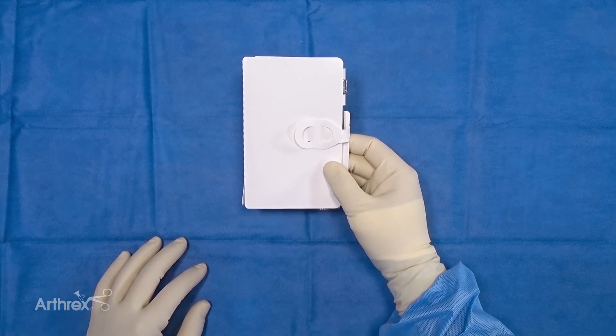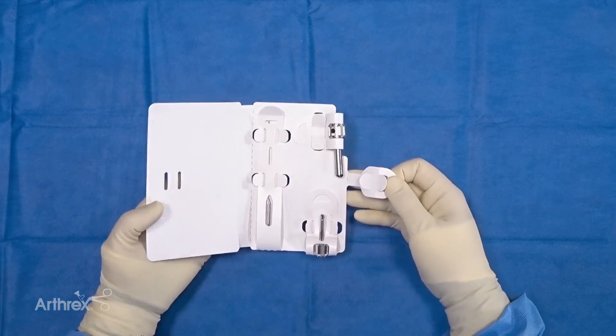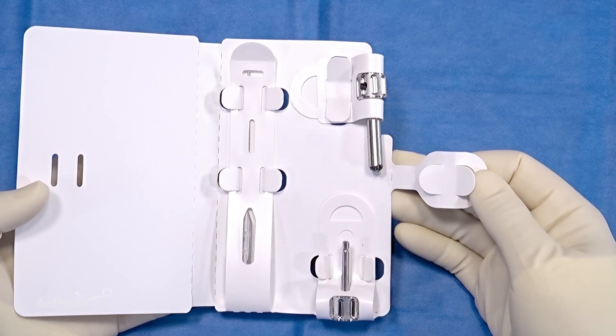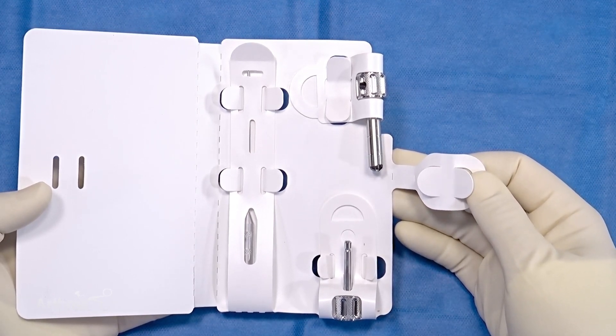Today we are going to take a look at the OsteoAuger Autograft Bone Harvesting System. This is a single-use system that collects autograft from various different patient sites, collecting morselized bone graft.